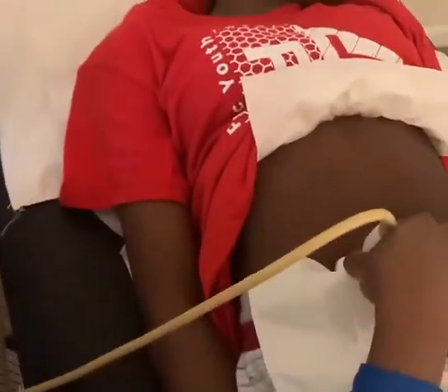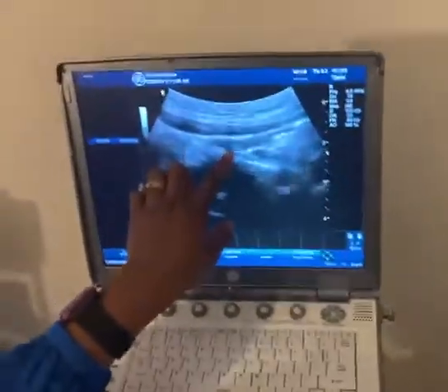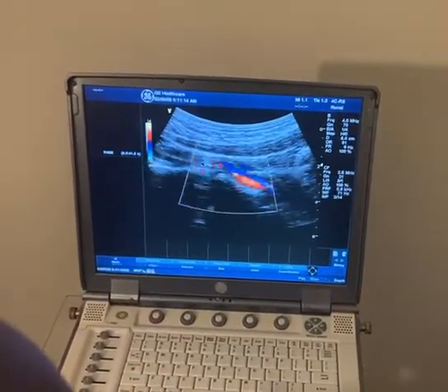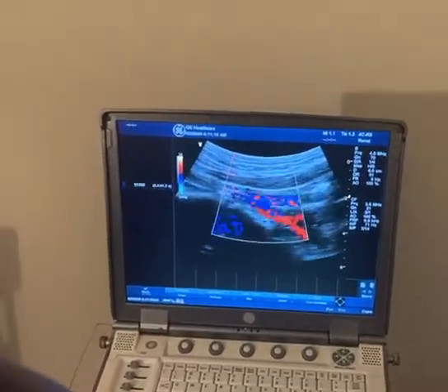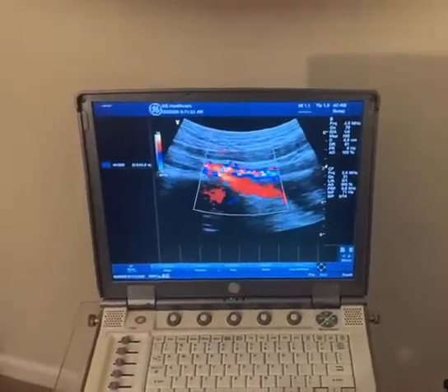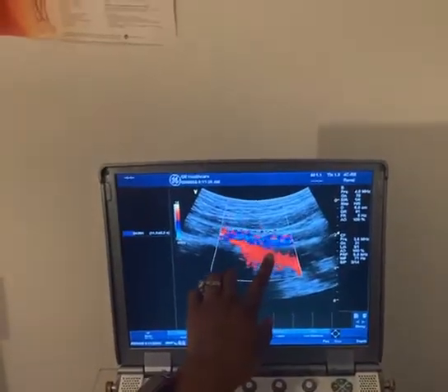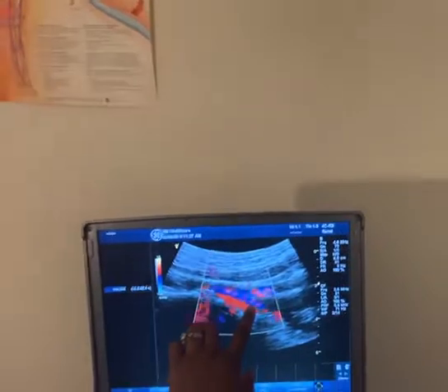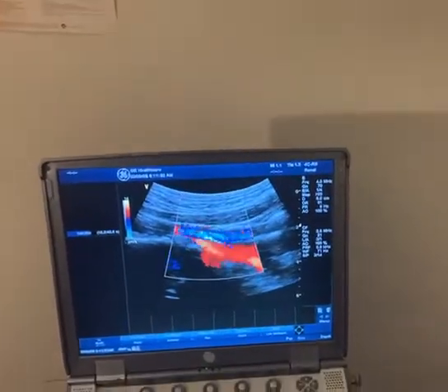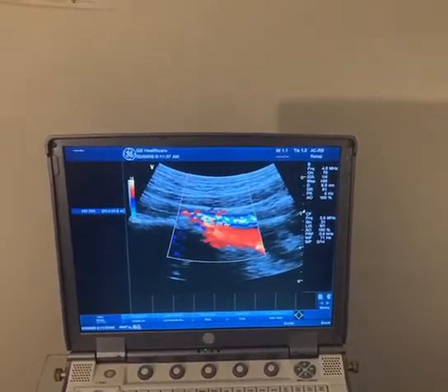I'm looking at the right vessel — I keep it in view and slowly turn on it. I'm going to put color on it. This study was done late in the day so she's a little gassy. You can actually see the common iliac artery and you can see the internal iliac artery also coming into view at that segment. At this point you can go ahead and save the images — you want to do that for your right side and for your left side.